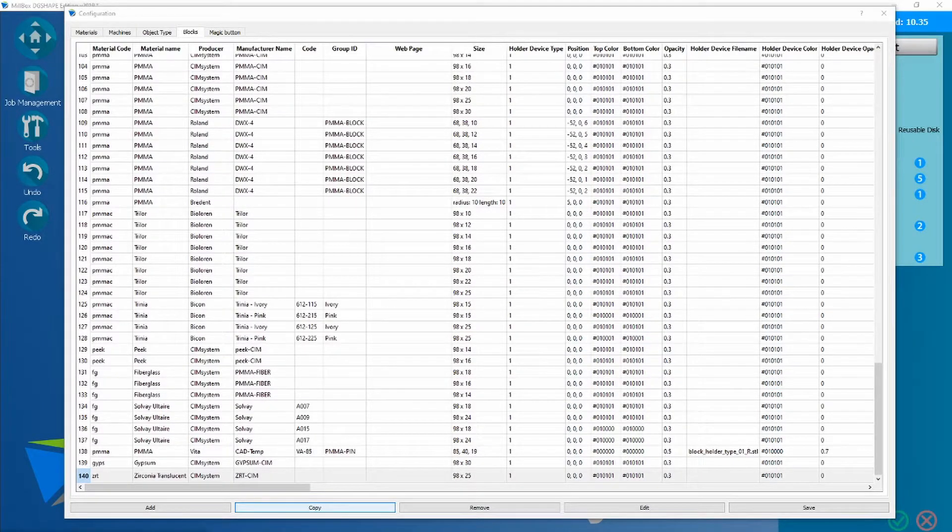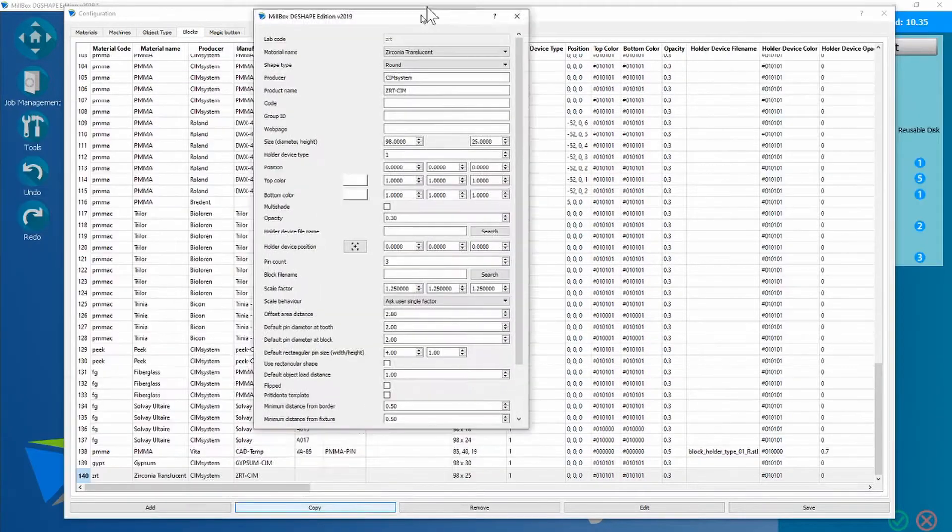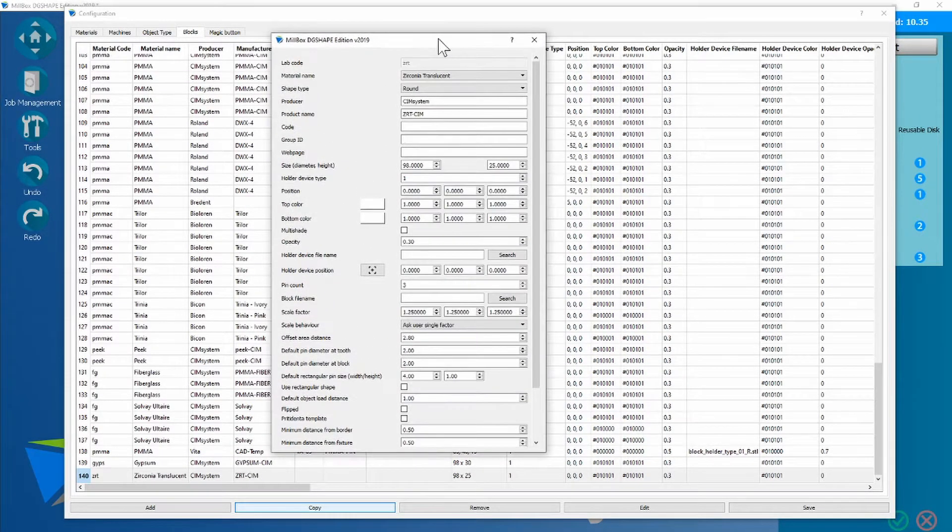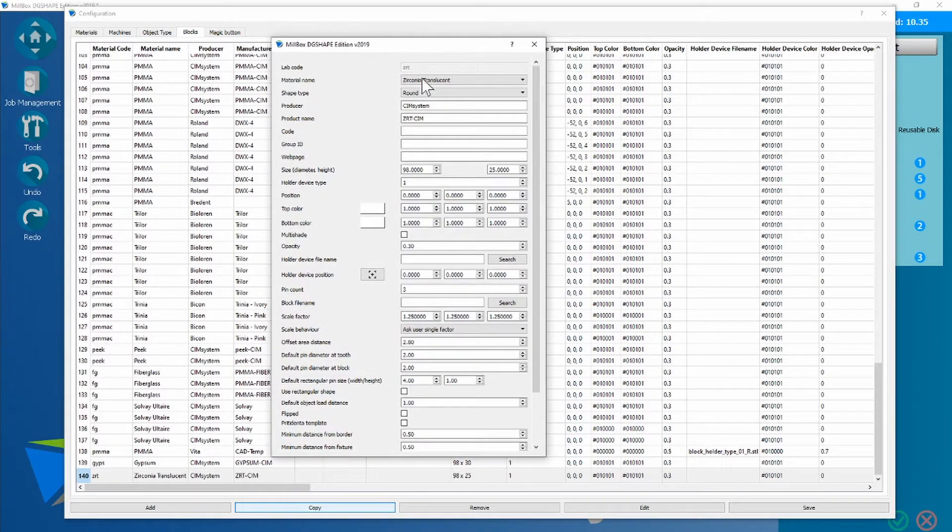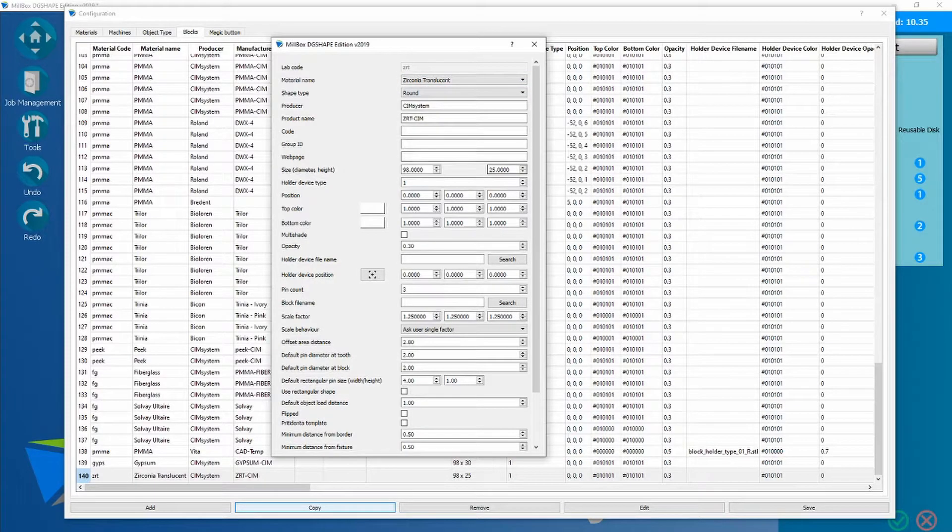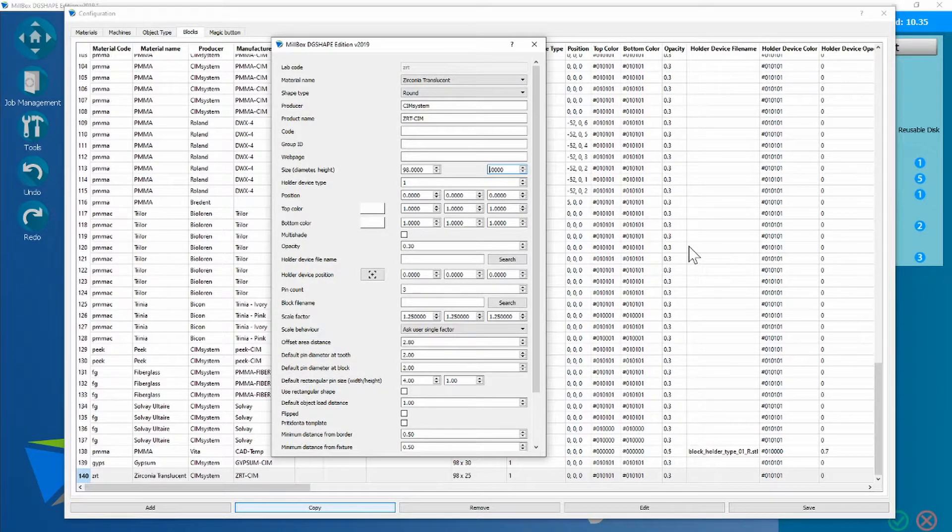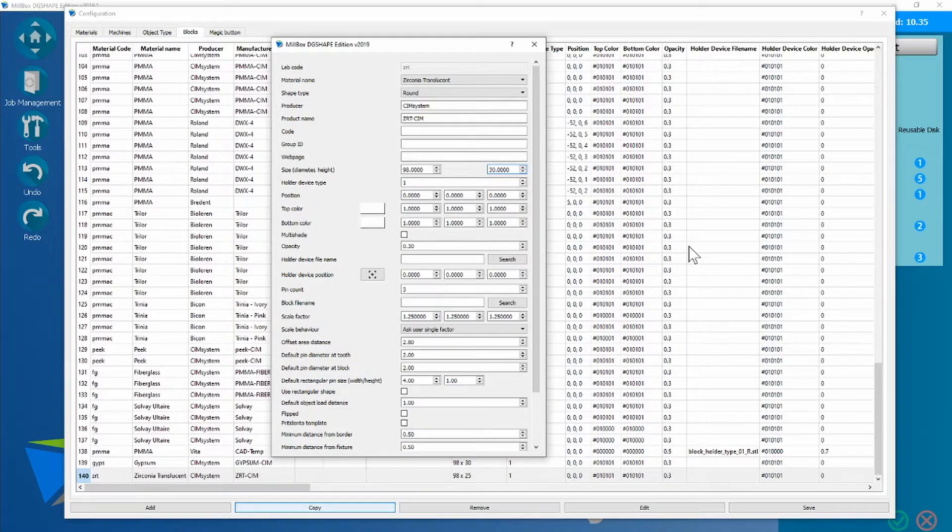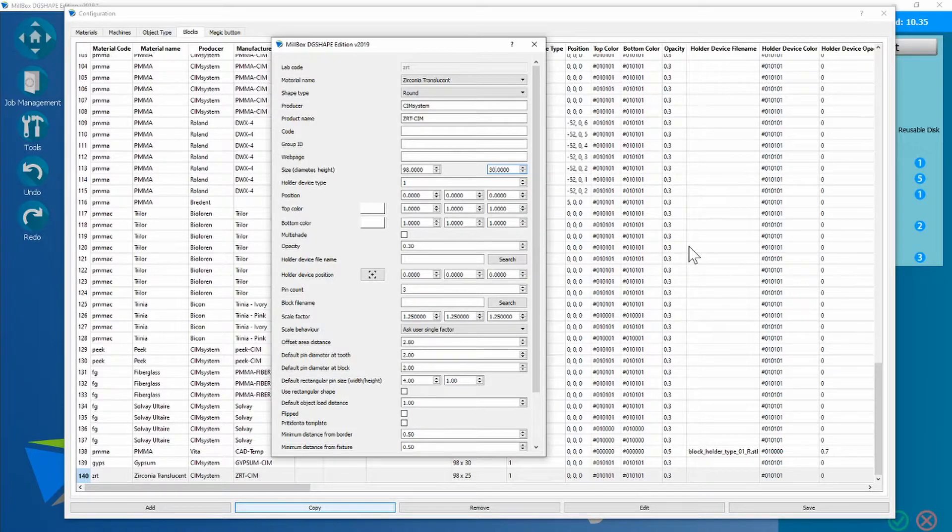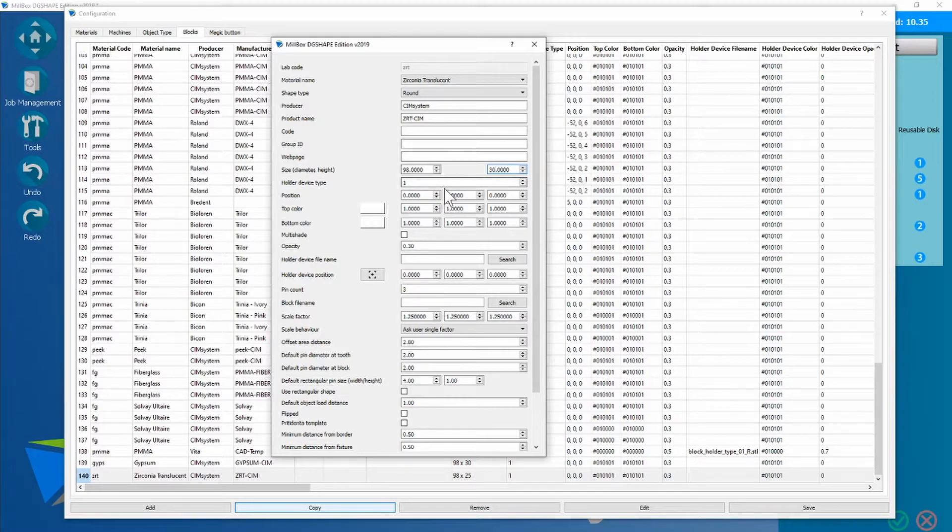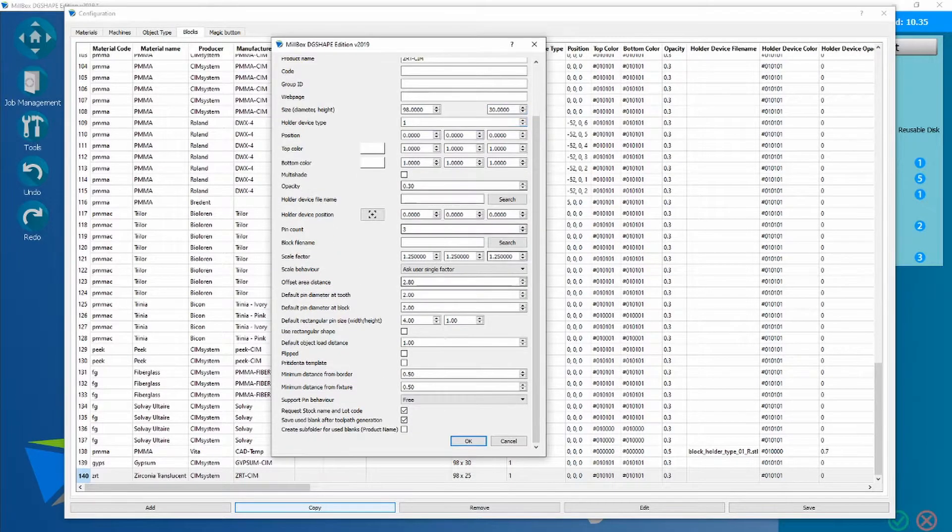This is going to open up another screen, and to change the size of a disk, you just add in the value that you want to create, which is 30, and if that's all you wanted to do, then you would click OK.